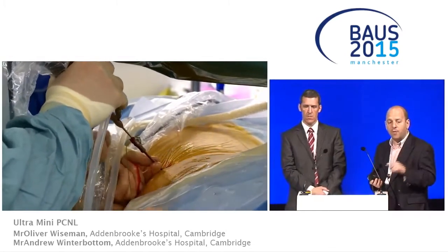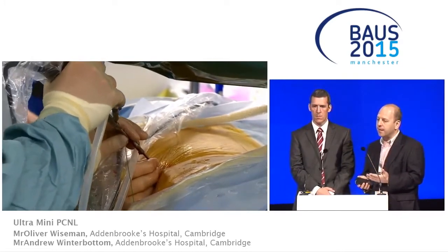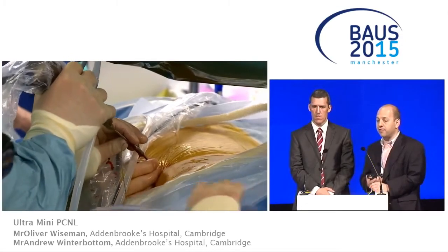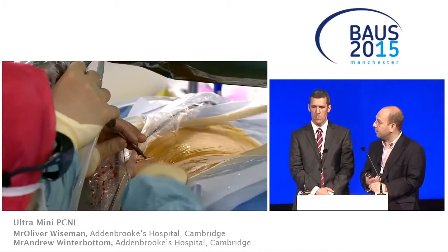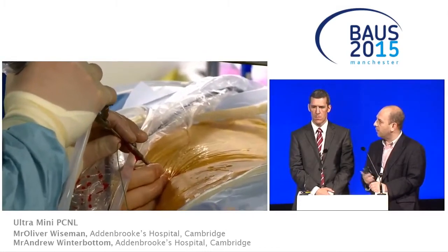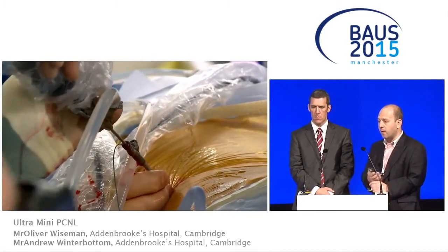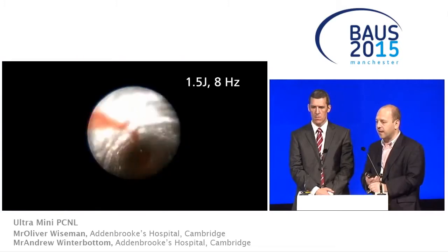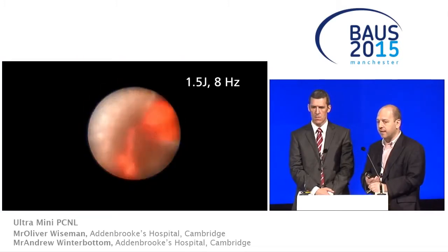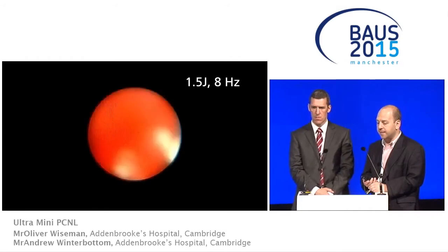If you have a wire going down, it affects your manipulation around the collecting system, and it also means that you can't flush out the fragments, which is one of the big benefits of doing this over a flexible ureteroscopy. So we have a wire down there at the moment, but very shortly we're going to remove the wire, and that then leaves us with just the outer sheath in the collecting system. So obviously it's very important that that's where it remains, or else we need to get access again.